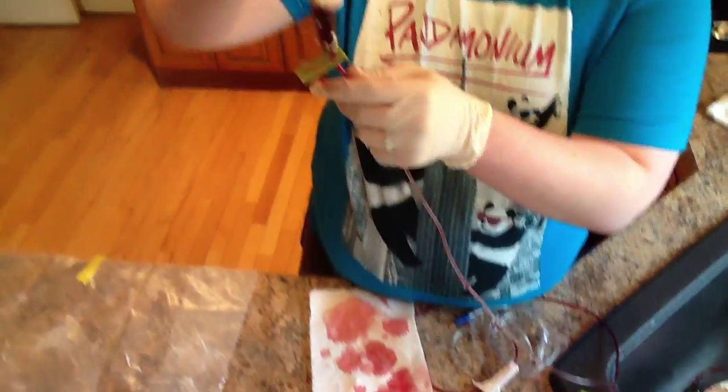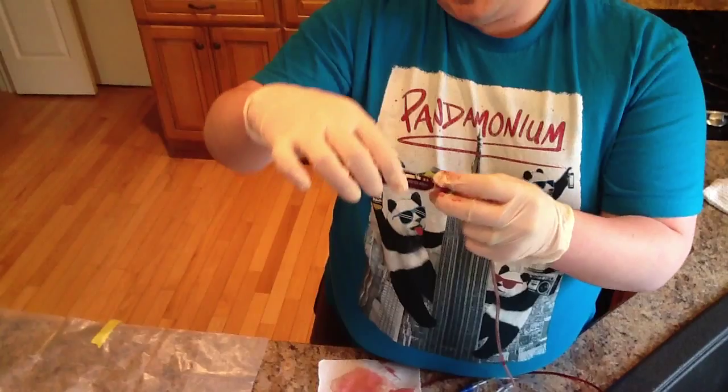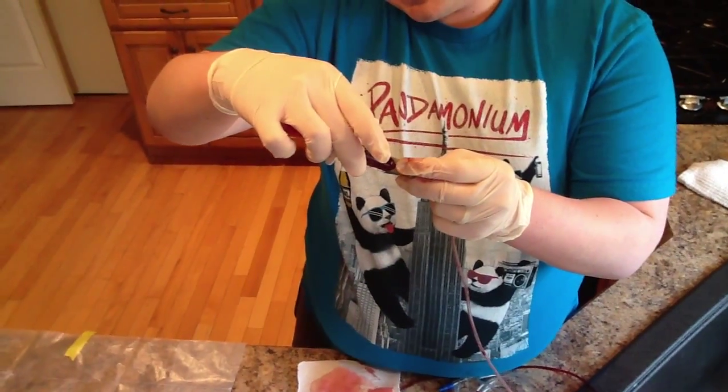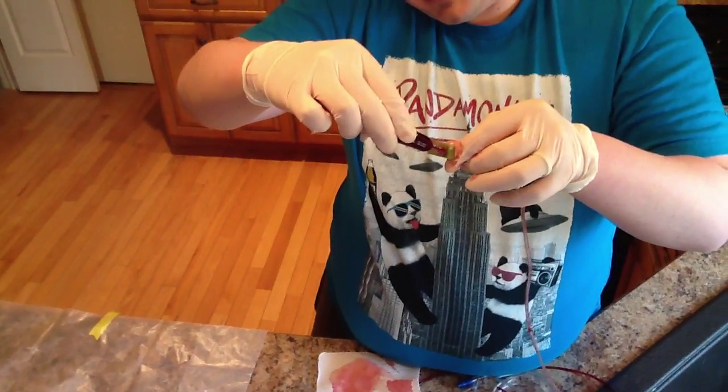Our hole was plugged. You can squeeze it, give it a good flick, and it's still holding.